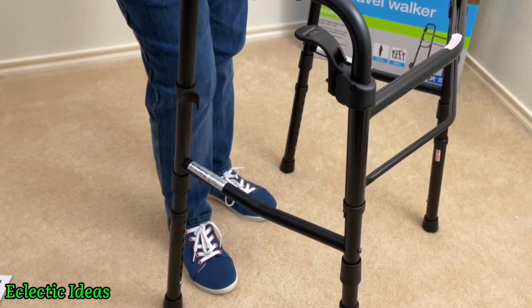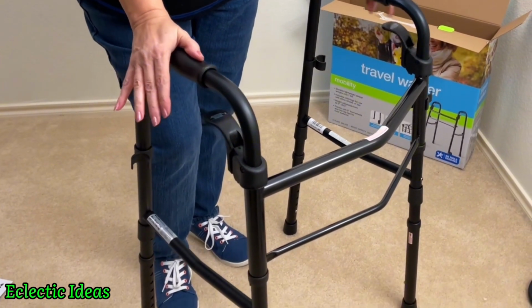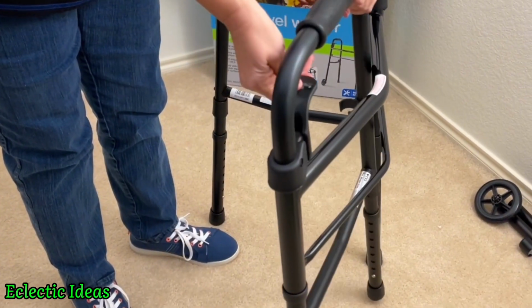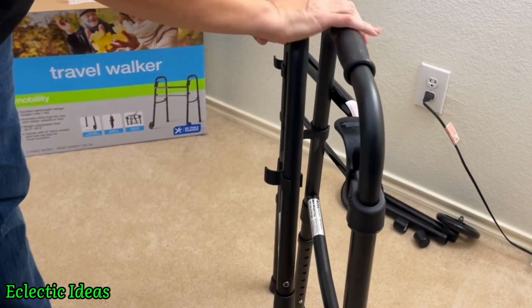We just have the glides on still. And with the glides on, it's pretty sturdy. And if you want to fold it up to put it in your car or stow it away, from a standing position, you can see that I just push these levers in. It folds up very easily with no tools, just like this. So if you're in cramped quarters, you could literally just fold it up to lean it and then just get it back out to use it again.